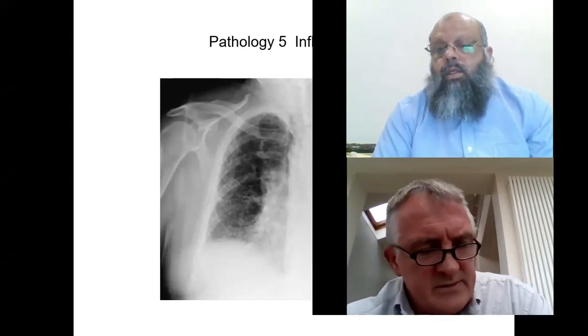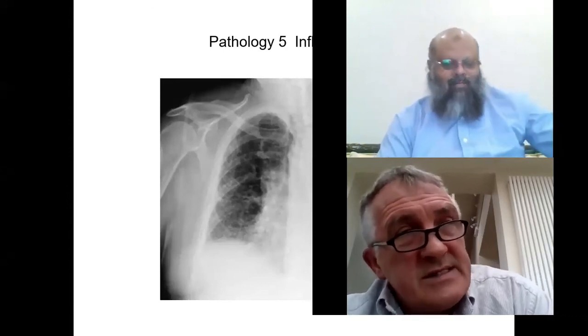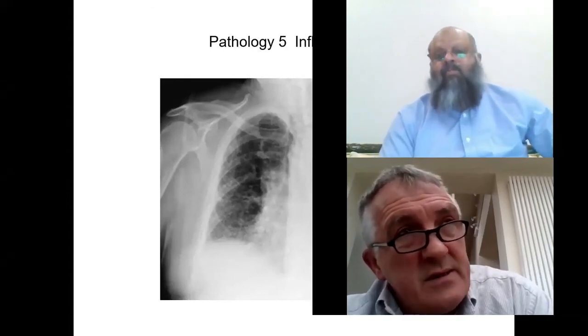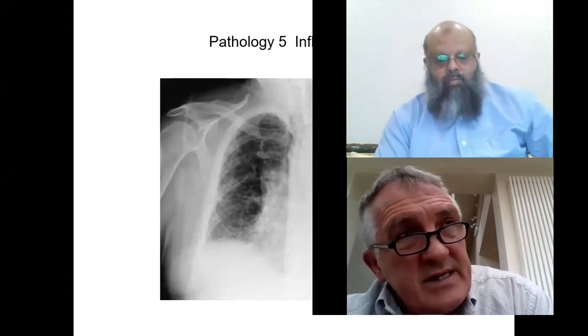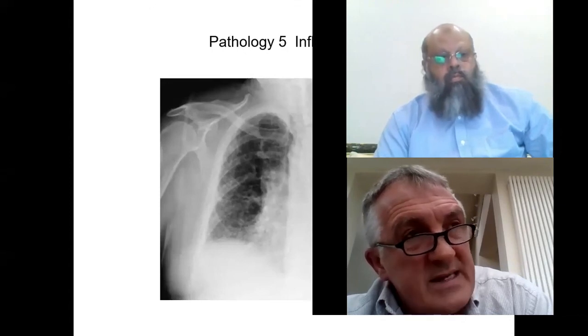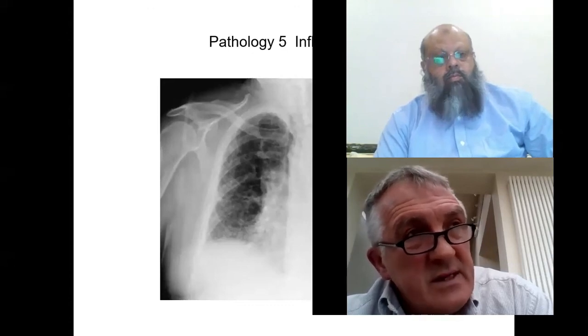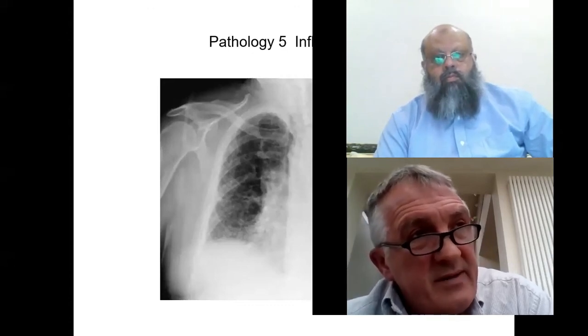Well, yes. They're two entirely different pathologies. A thrombosed vessel is a filling defect in a contrast-filled vessel. It's actually one of the key things about radiology: where is the pathology? Is it in the lung fields? Is it in the pleura? Is it in the bone? Is it in the blood vessel? So you will see within the blood vessel a filling defect surrounded by contrast, and that is thrombosis.